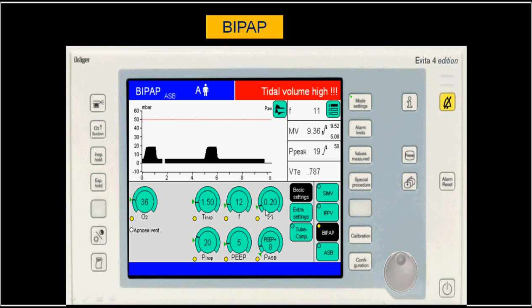On the Drager, you also set the rising time — how fast you go up to the high CPAP — and the pressure support, which is set above the lower CPAP. For example, pressure support of 8 above a lower CPAP of 5 gives a total of 13 cm of water. The rising time is also set, and the expiratory sensitivity for pressure support is fixed on this machine.